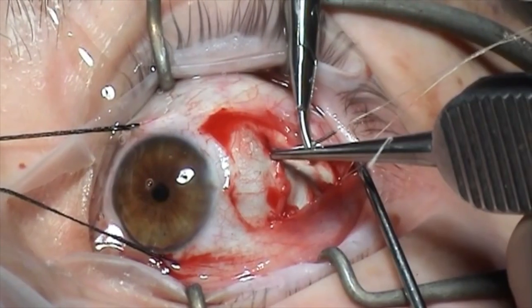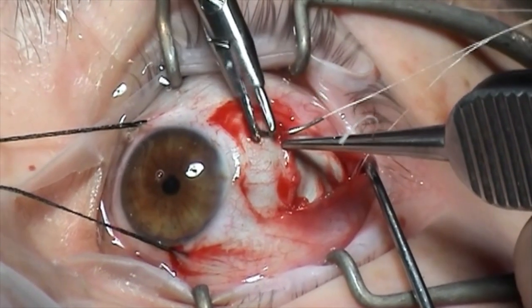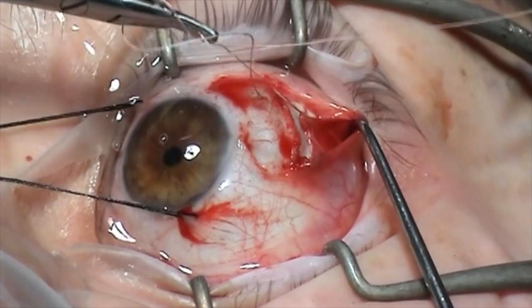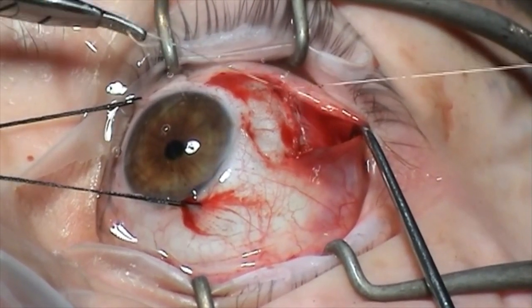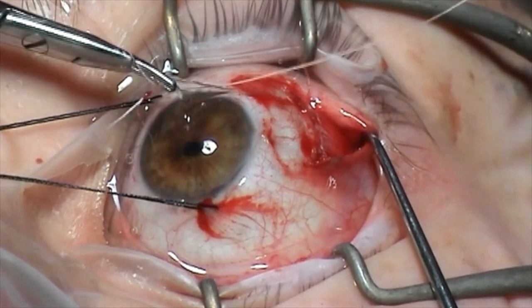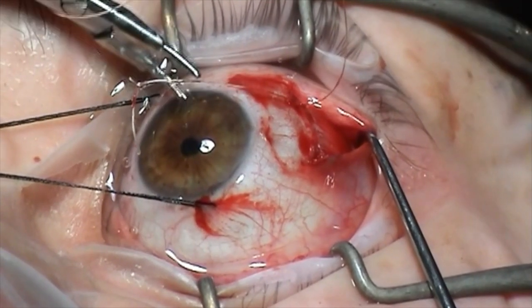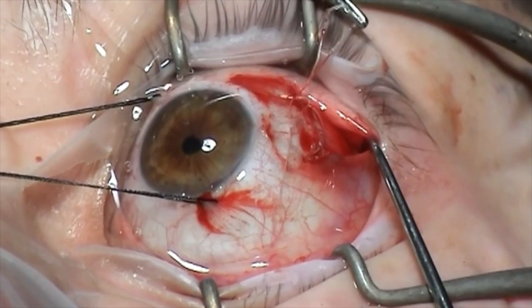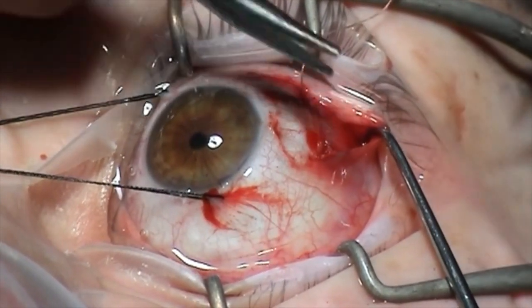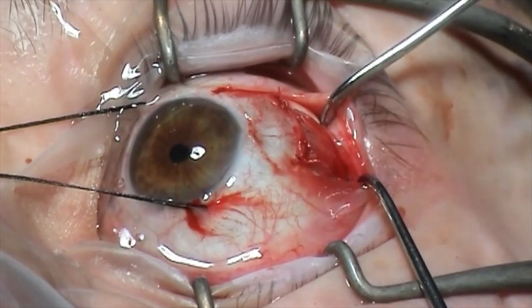Cutting the suture two millimetres or so from the insertion. Then holding the muscle right at the superior margin of the original insertion, placing the suture through at this point with a nice scleral bite and reattaching the muscle. You can see how it's beautifully spread here, now reattached along its length, directly opposed to the original position of the lateral rectus. Cutting the sutures two millimetres from the knot and displaying the muscle nicely spread.